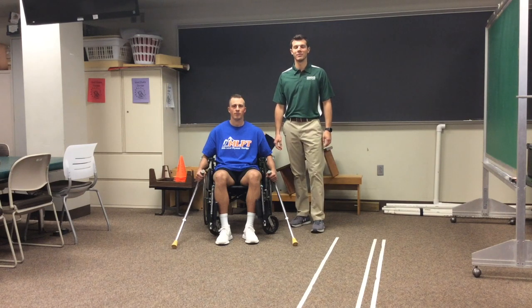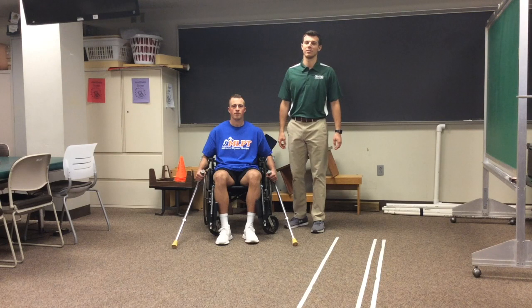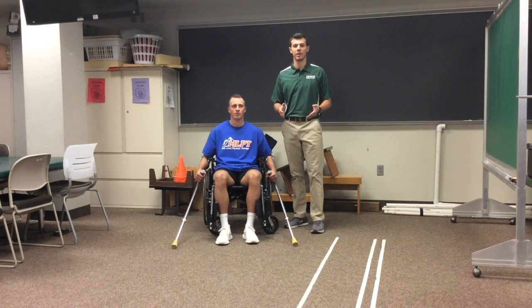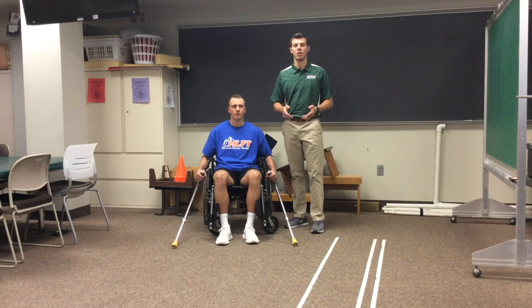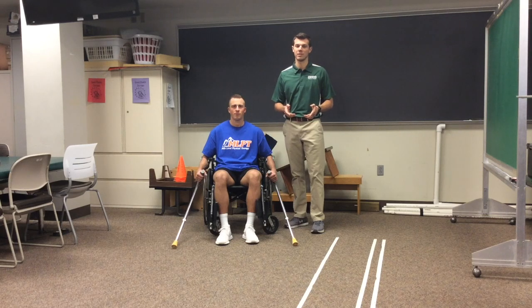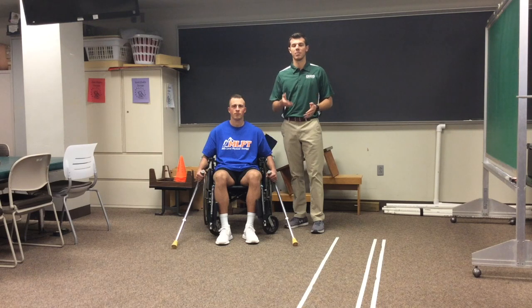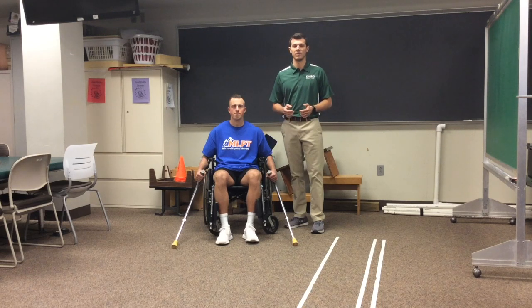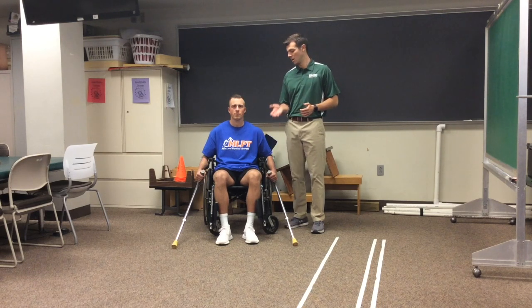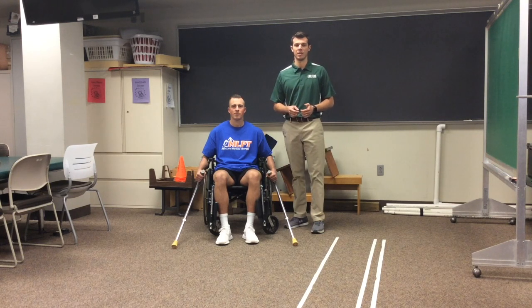Hi, my name is Ryan, student physical therapist. In this video we'll be learning how to use the four-point gait pattern and the two-point gait pattern using Lofstrand crutches. The majority of this video will be comparing the two gait patterns, but at the end I'll be teaching you how to return to the wheelchair using Lofstrand crutches from the standing position.